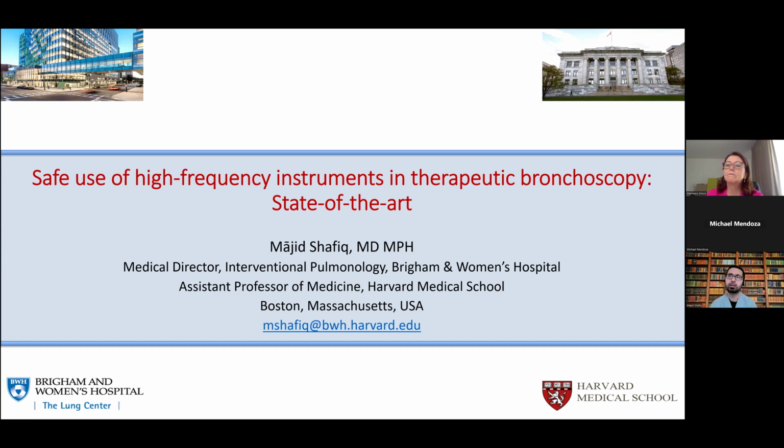Yeah, and you're right. That is so true. A lot of the time that base is just so wide. What I have learned is not one approach, but here's a couple of things that I try. One thing I try, if the tumor isn't particularly vascular, is cryoadhesion, often with great results, because that might be the quickest way to do it. Just start cryoadhesions and yank out as much as you can at a time.